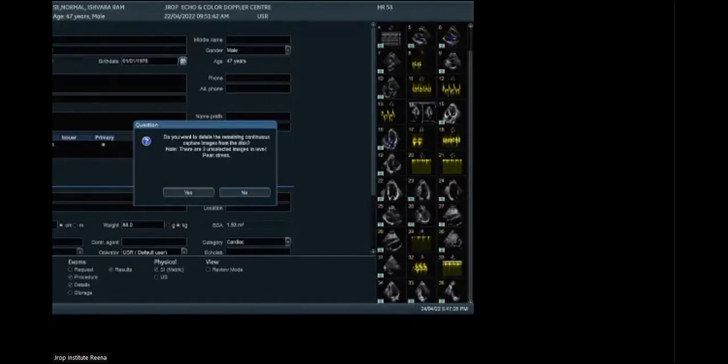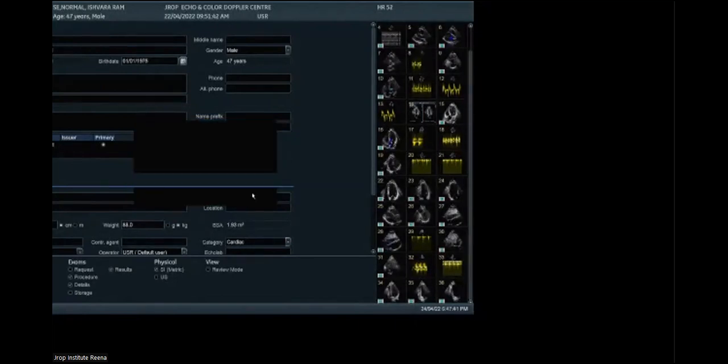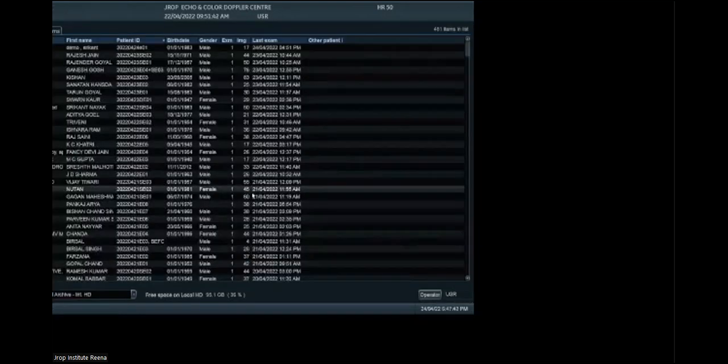Sir, what is diastolic dysfunction and how do we look for it? We will come to diastole. Once we finish this, then we'll start with coronary artery disease, systolic and diastolic functions. Sir, do you have any recorded video of coarctation of aorta? Recorded video of coarctation of aorta. Yes, sir. Oh, this man has got a coarctation of aorta only. We got him stunted.